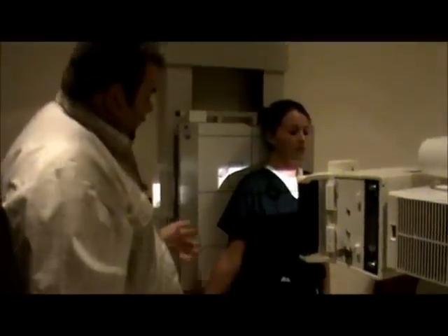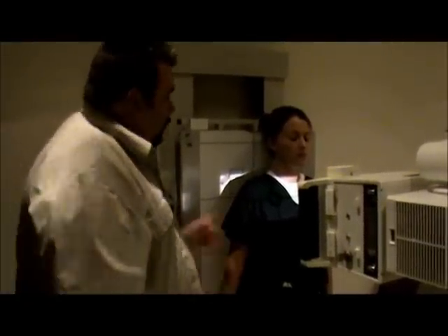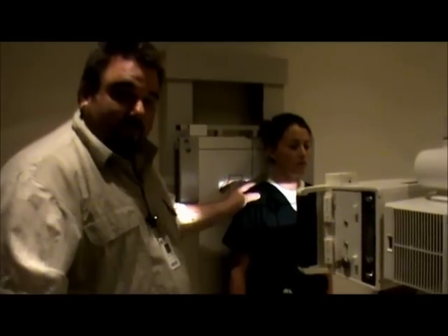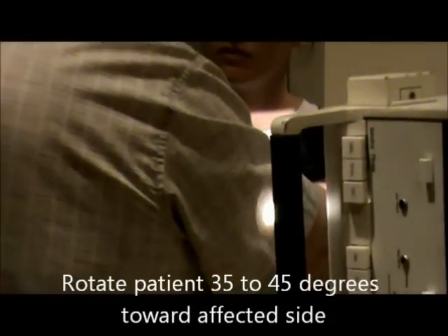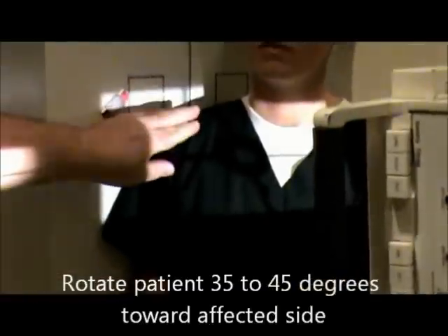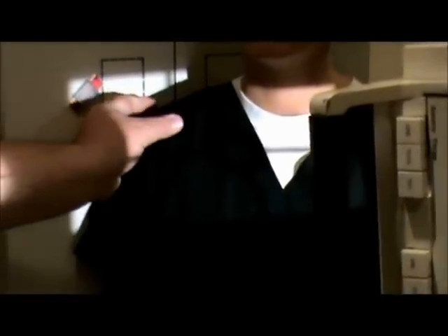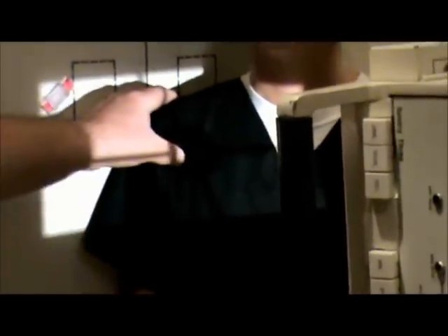Our next view is going to be our Grashey view. We're going to rotate the patient toward the affected side 35 to 45 degrees. How we do our centering is we actually palpate the shoulder — we put our finger on the shoulder and roll it around. As you go around, you'll notice that the finger sort of goes in. We call that 'the dip,' and that's going to be our centering point. We'll adjust our patient so that centering point both ways is at the dip.